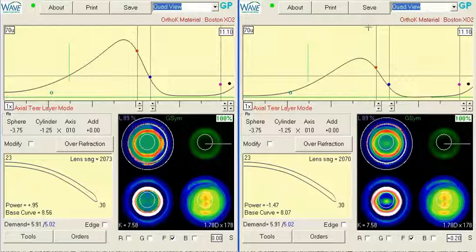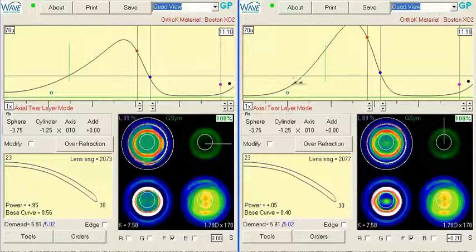This does make the optics a little bit funny since it's aspheric. Also keep in mind that for a -5 total power, especially in the vertical meridian, we're still molding quite a bit within the pupil, so hopefully this lens will be better than the prior lens, but it's going to be very difficult to get rid of halos and glare altogether in a case like this.